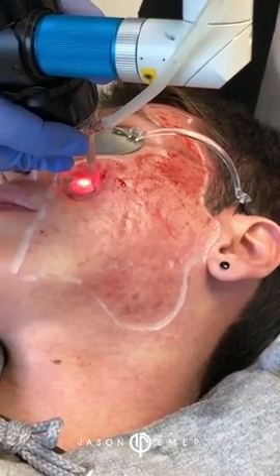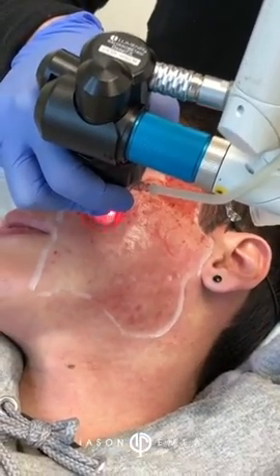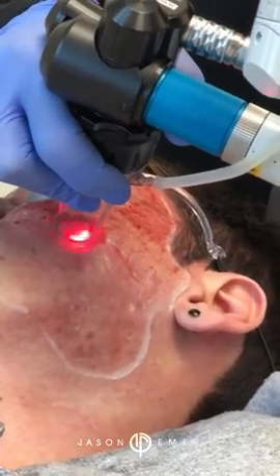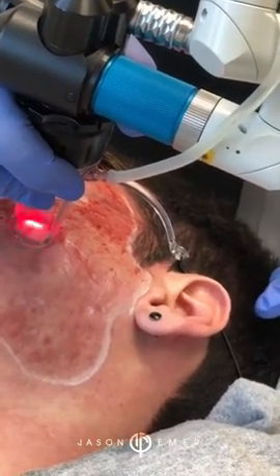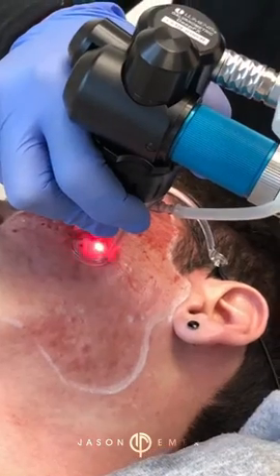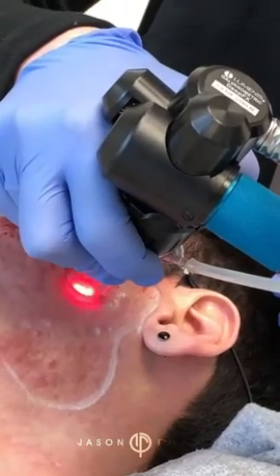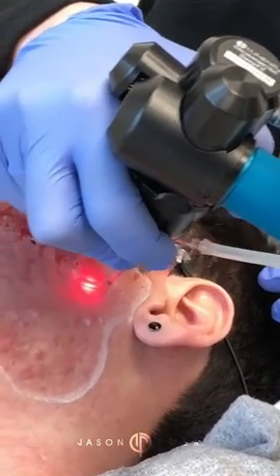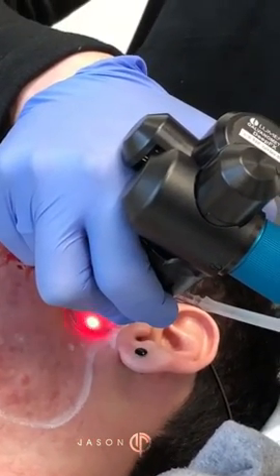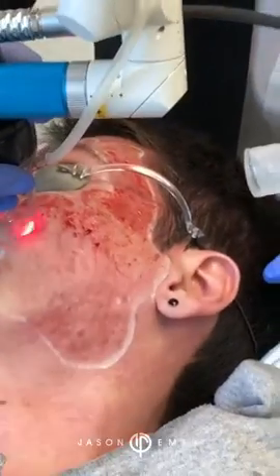And the skin type. For me, I love doing Fraxels twice a year to help resurface, and I also love doing erbiums. What's great about the erbium, also known as the cool laser, is we can treat fractionated around the entire skin but then maybe people have lip lines they don't like, or wrinkles around their eyes we don't like. We're able to change that laser to do ablative in those areas, treating the rest of it fractionated. So we're really able to cater those treatments depending on what we're trying to treat. Fractionated is going to be safer in darker skin types than ablative would be. Okay, stop right there. Just don't go too close to the eye.